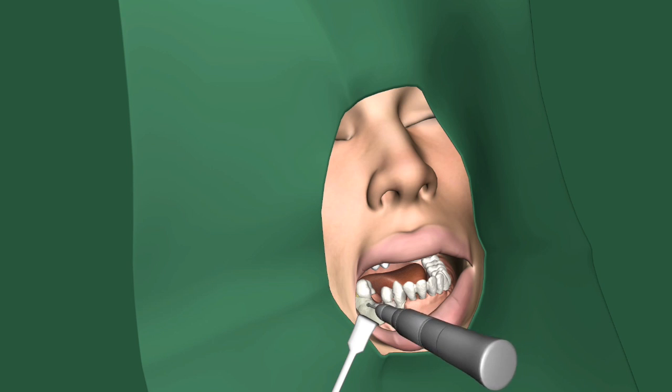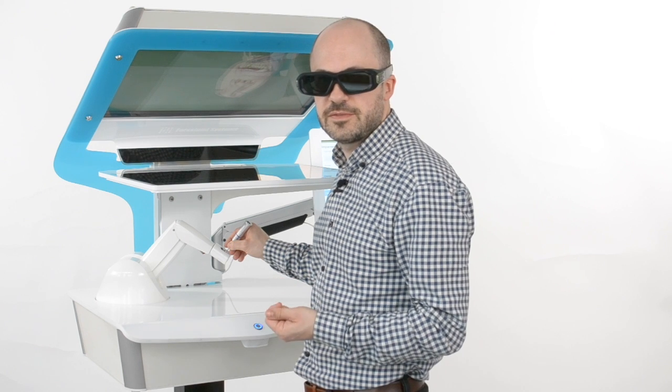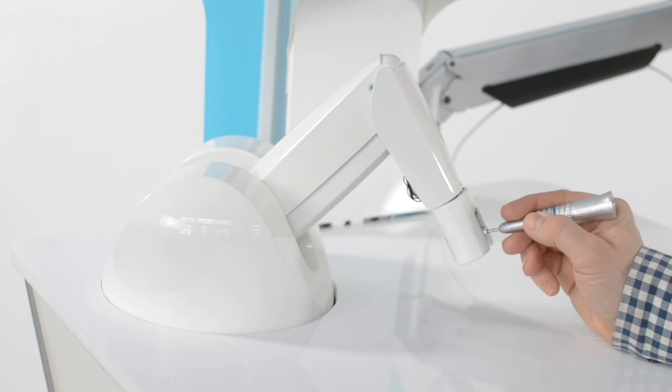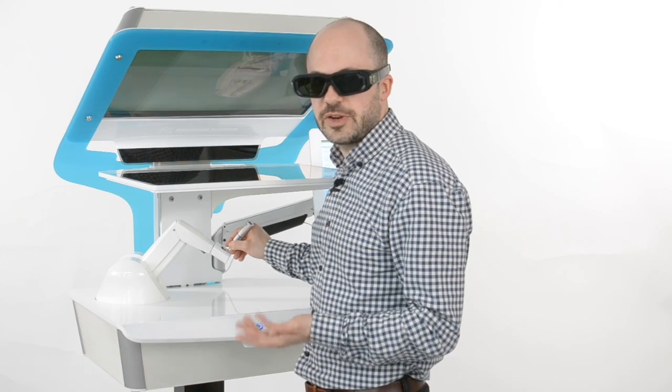When I show the simulator to new users, I usually recommend them to find and touch the surface of the teeth with a virtual instrument. This way you can actually feel and explore the shape using your sense of touch. When you are used to how the instrument works, you can start drilling.